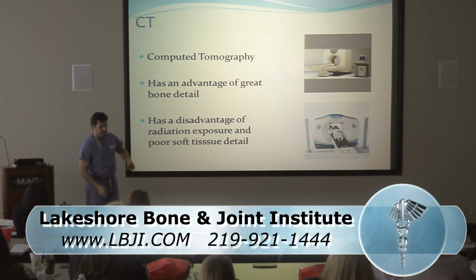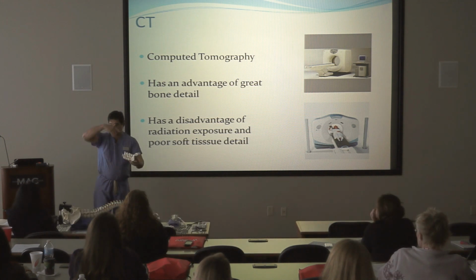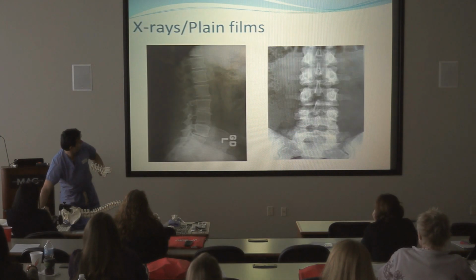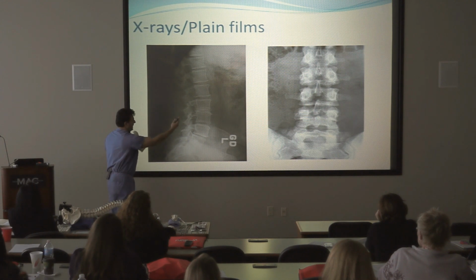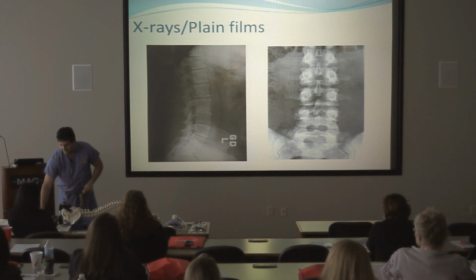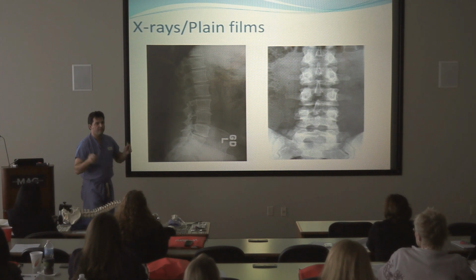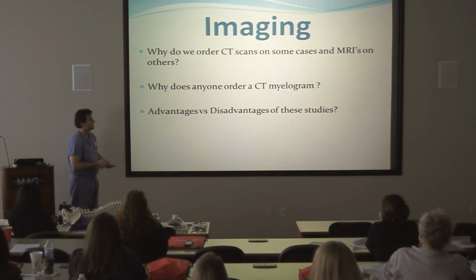And why that's important is if you take an x-ray through a spine, you're taking an x-ray just like you see here on this previous image. There's bone here, there's no bone here. When that x-ray is taken, now it changes a few degrees, takes another x-ray. Well, there's still going to be no bone here, and these bones are going to be taken at a different angle. The computer interprets that and gives you a very clear picture of the bones with much more detail, because it's many, many x-rays taken at one time, and the computer puts all that information together and generates an image for you. Okay, and you'll see what that looks like.